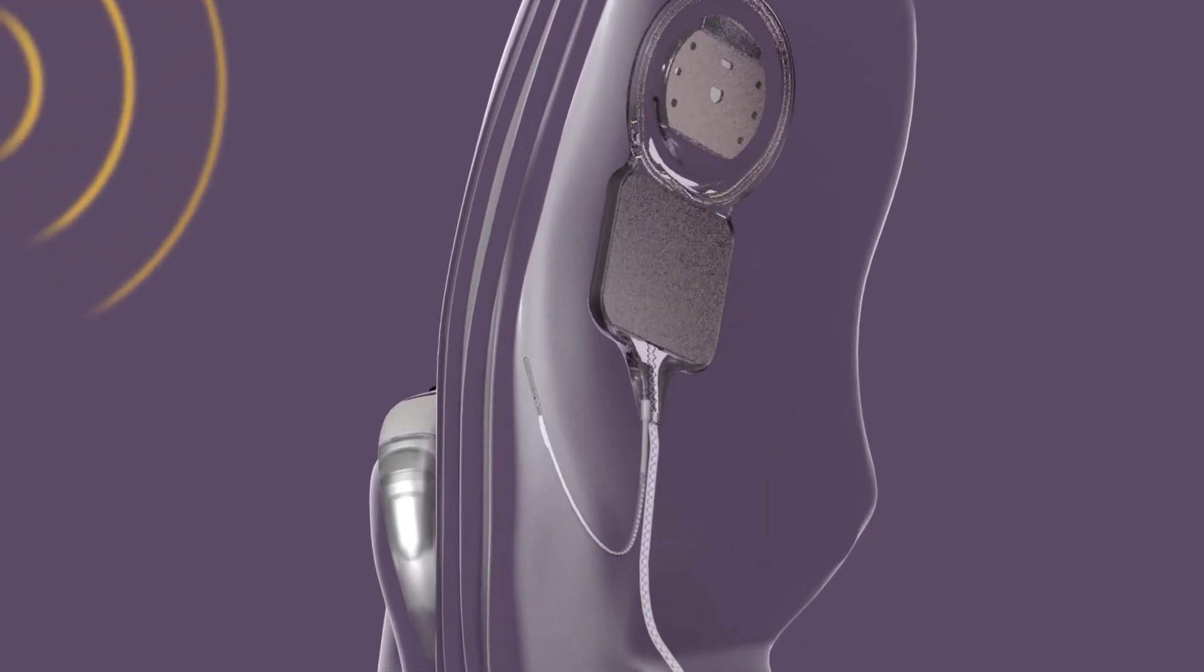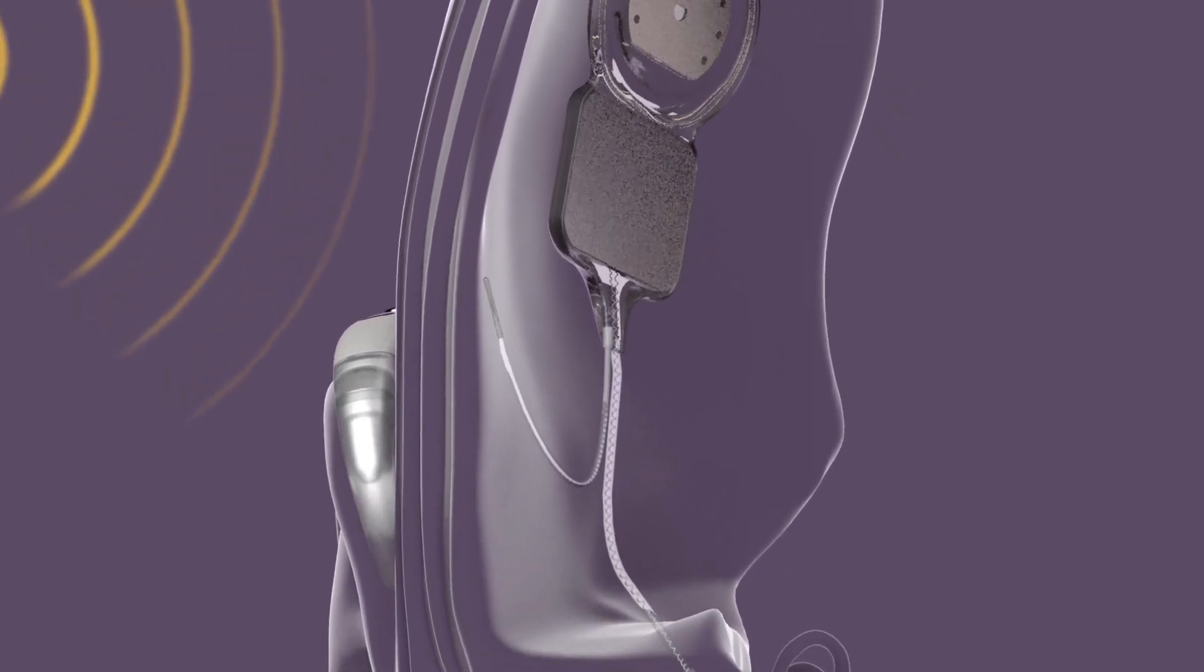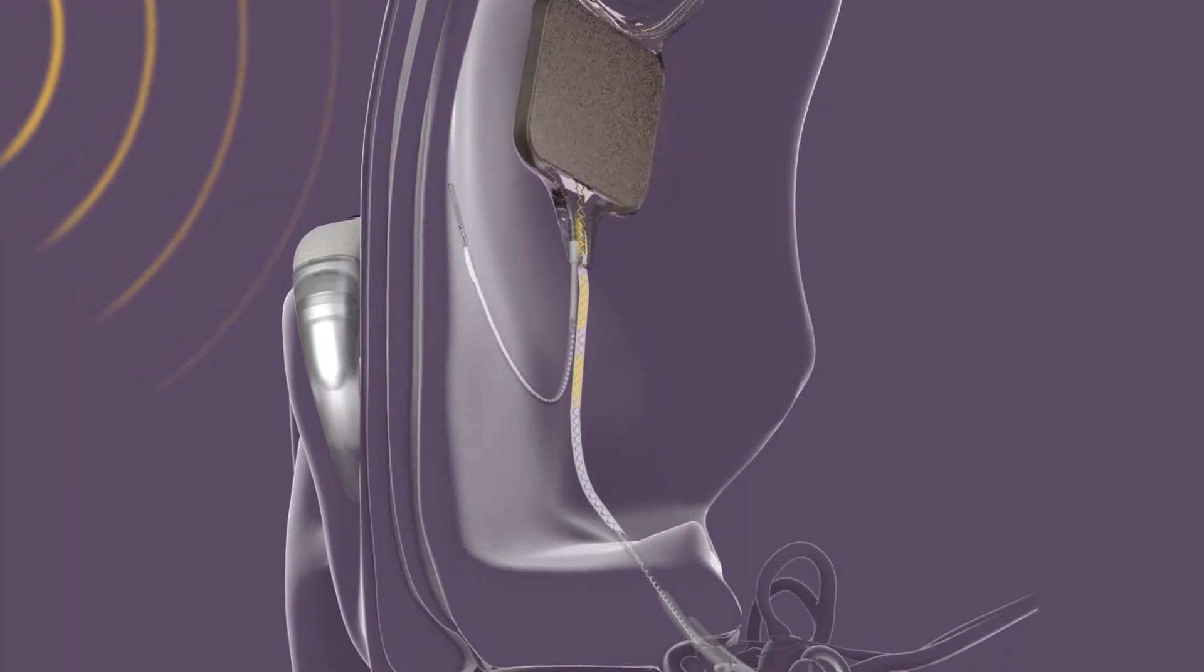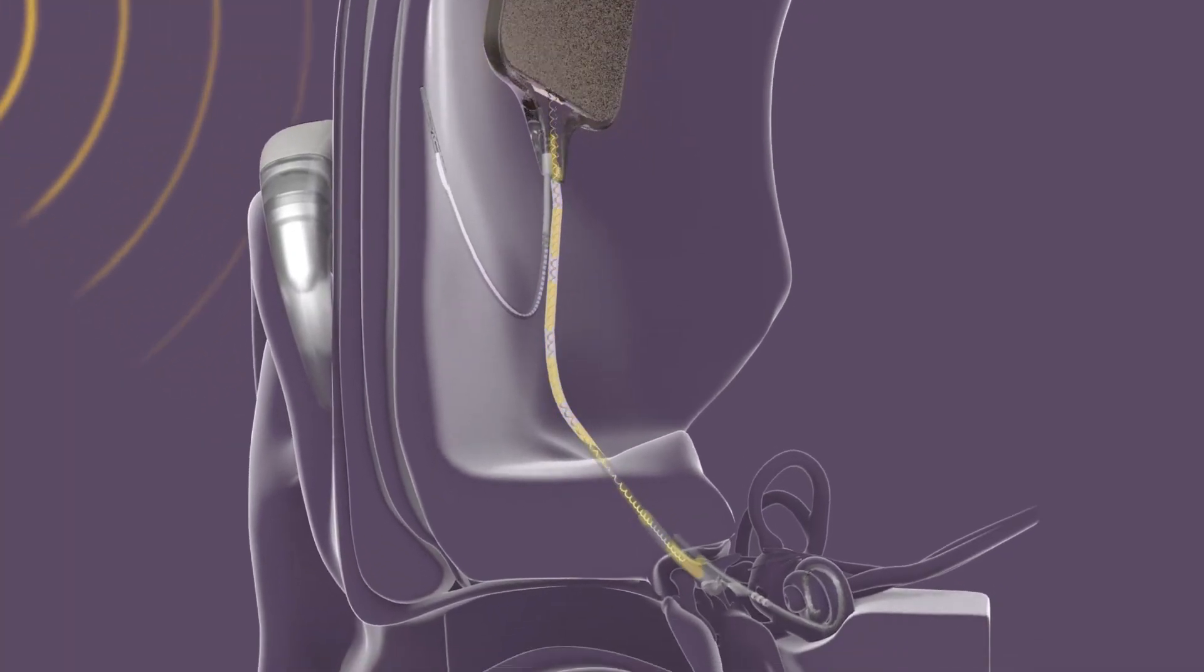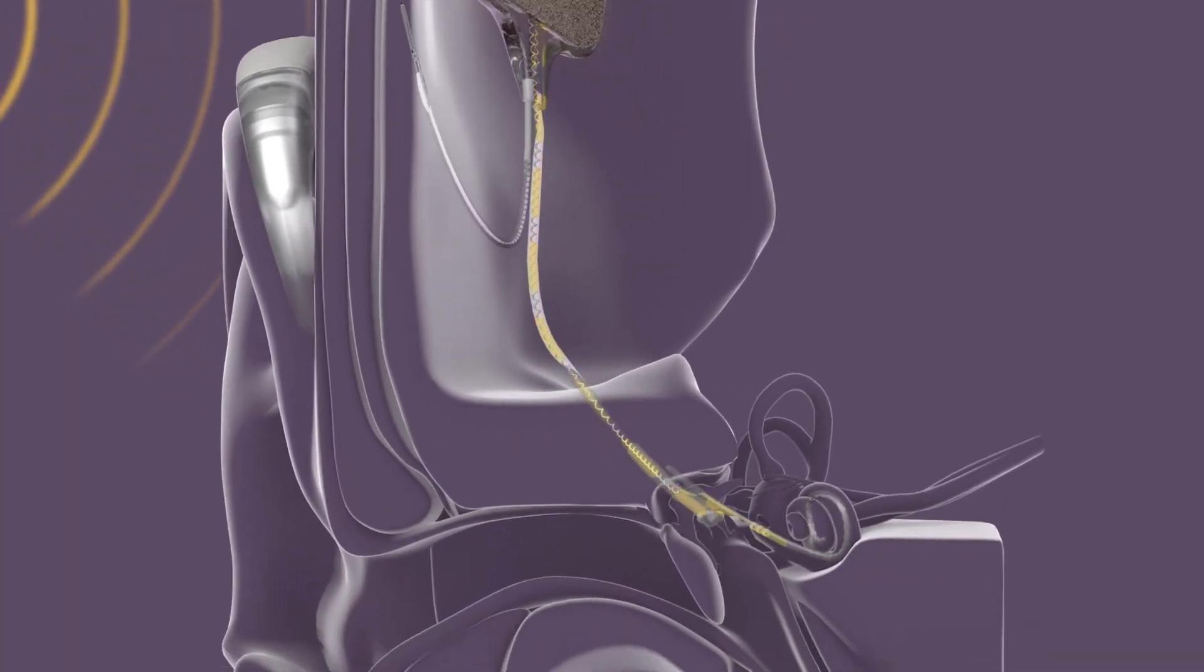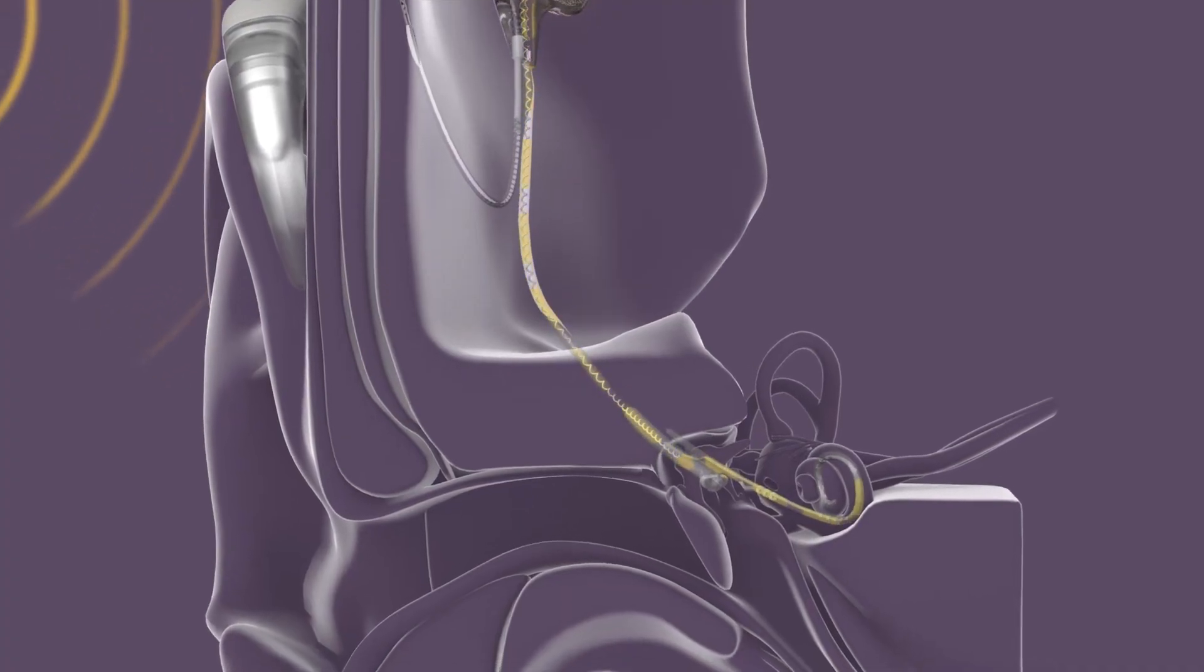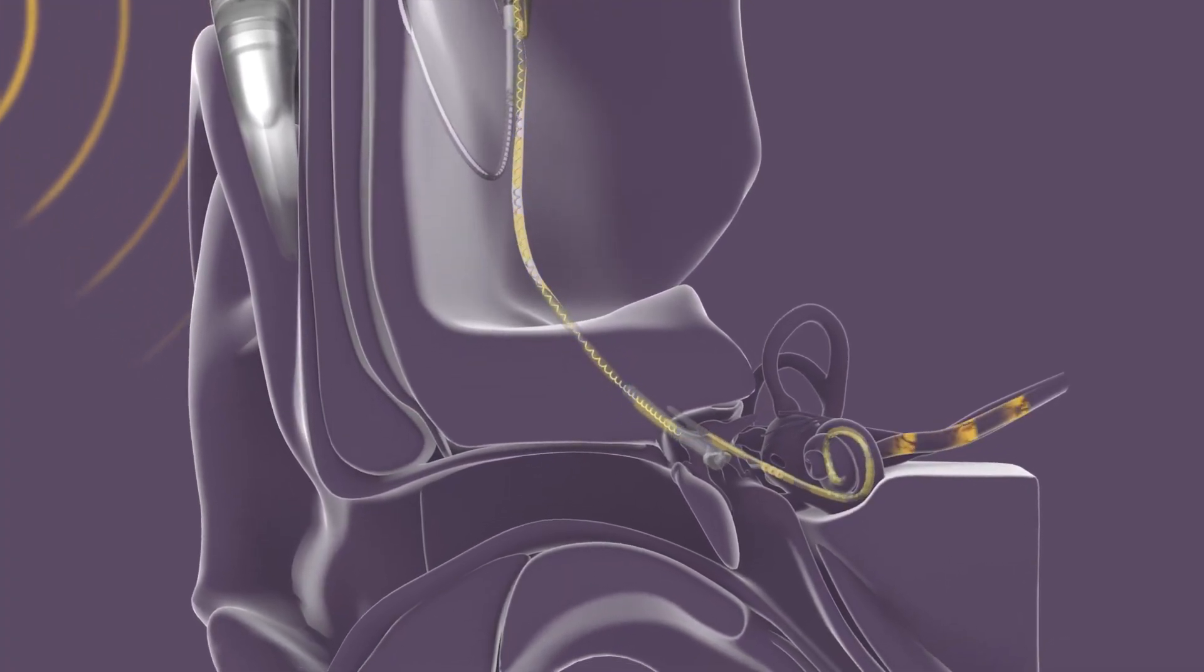Sound is picked up by two microphones on the sound processor and sent to the implant, where it's converted into signals that are sent into the cochlea via the electrode and are interpreted by the brain as the sounds you hear.